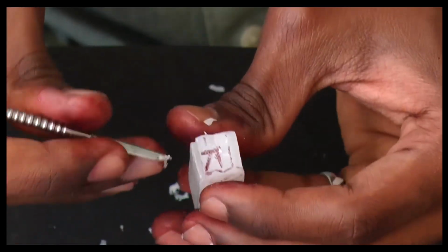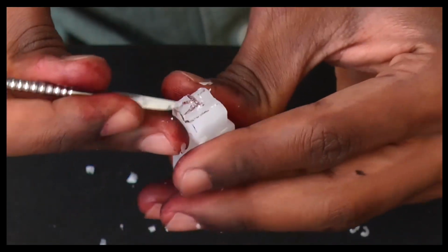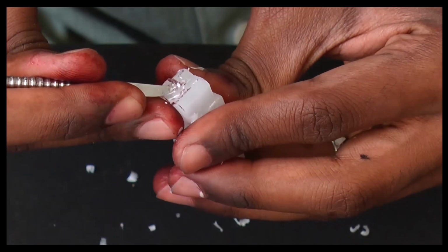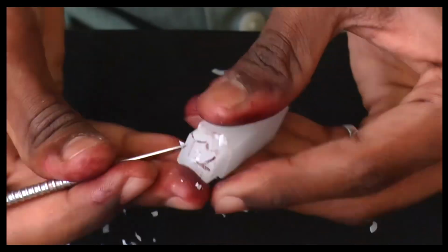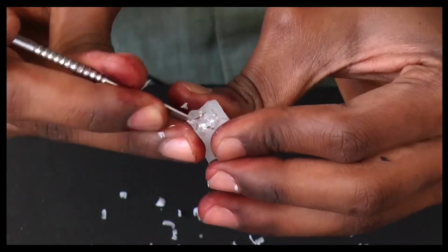And when you're doing these 2 cusps, be very careful, because these are very delicate, very small cusps.